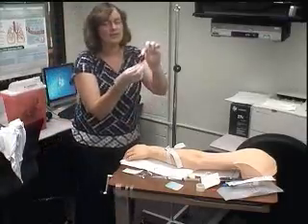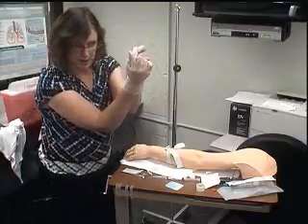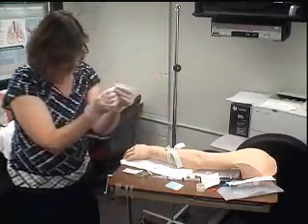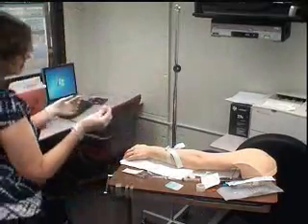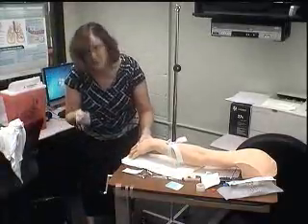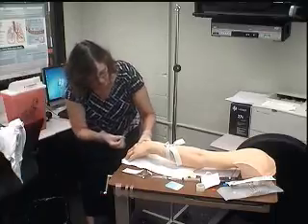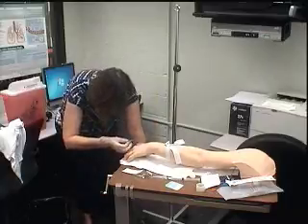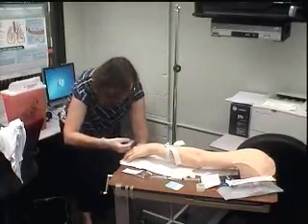Okay, so I've never touched this, pretend, okay? So this is my catheter. This little hub part right here is going to be up. If you can see the bevel of the needle, that part is going to be up as well. So I'm going to pull my arm down and stabilize my vein. The hub is up, and I'm going to insert at an angle of about 10 to 15 degrees.